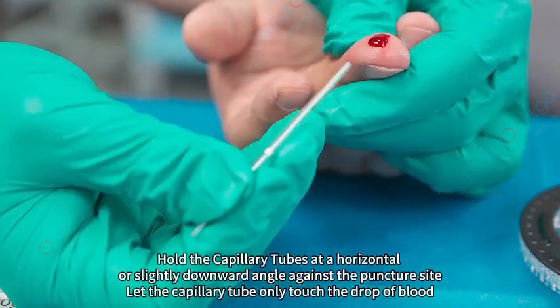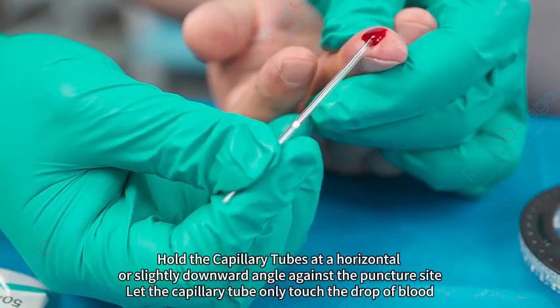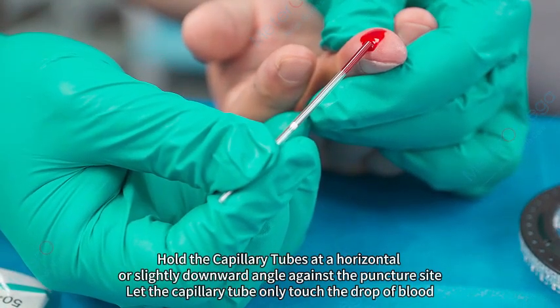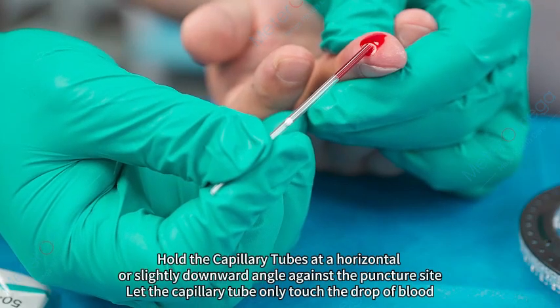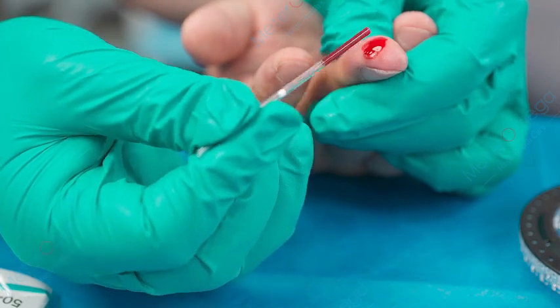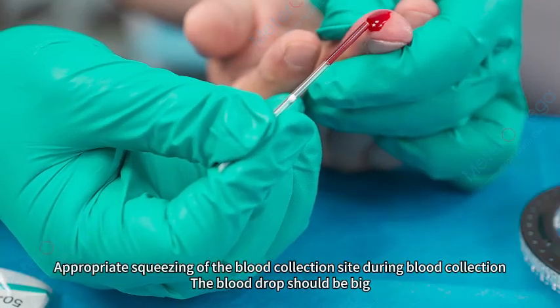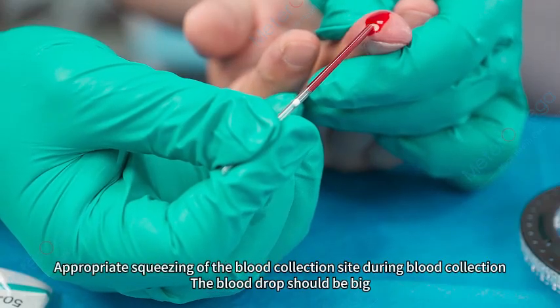Hold the capillary tube at a horizontal or slightly downward angle against the puncture site, letting the capillary tube only touch the drop of blood. Apply appropriate squeezing of the blood collection site during collection — the blood drop should be big.